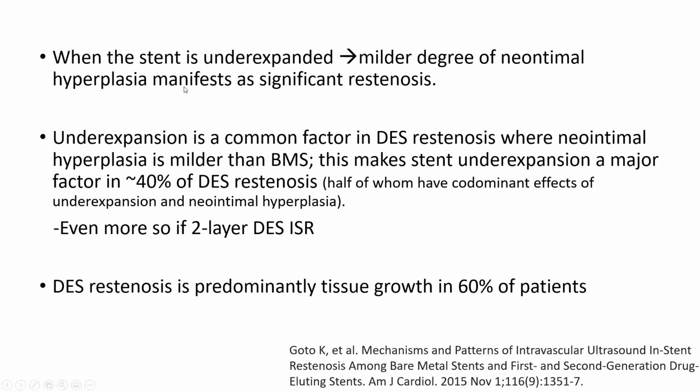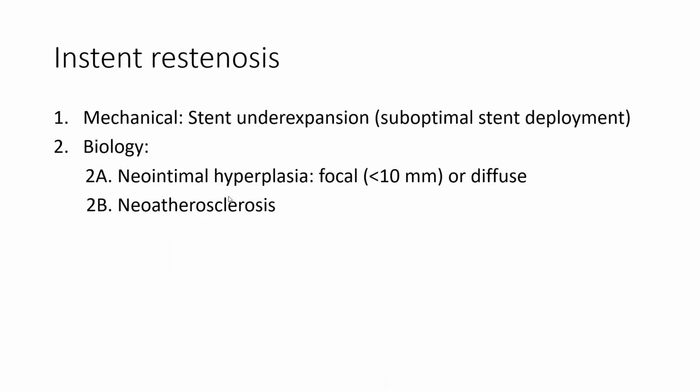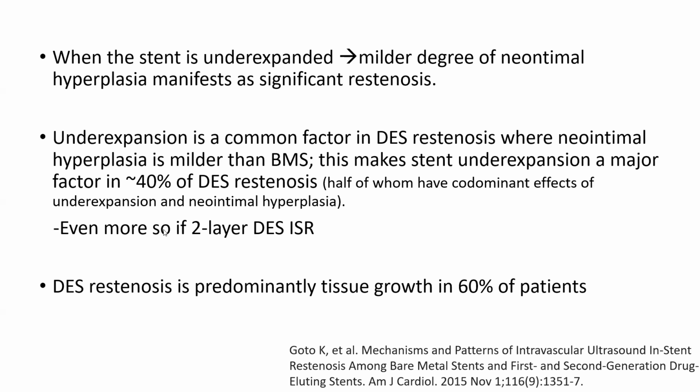Regarding stent underexpansion, it's very important in today's era, especially in our treatment of heavily calcified disease. When the stent is underexpanded, a milder degree of neointimal hyperplasia and tissue growth will manifest as significant stenosis. Underexpansion is a common factor in DES restenosis, where neointimal hyperplasia is milder than what you see with bare metal stent, and therefore stent underexpansion becomes a major factor in 40% of DES restenosis, half of which have codominant effects of underexpansion and neointimal hyperplasia.